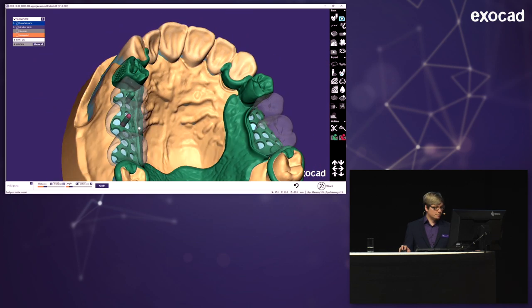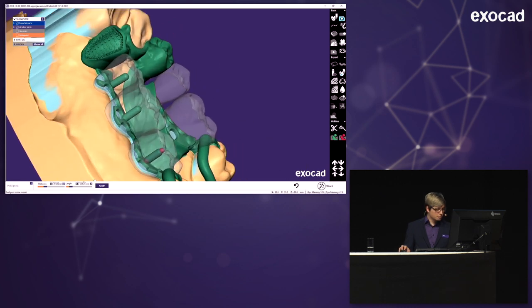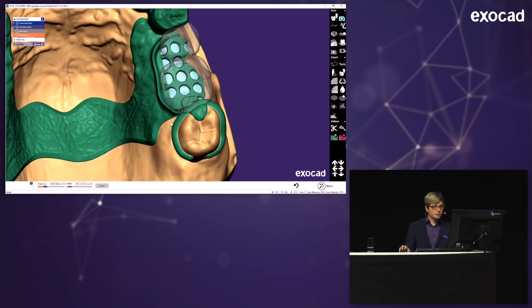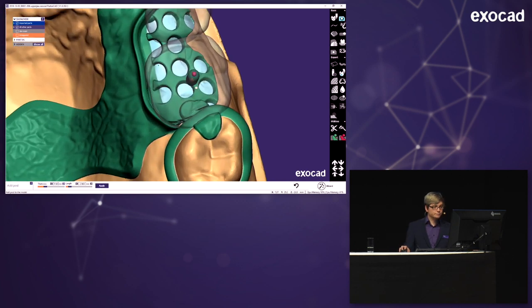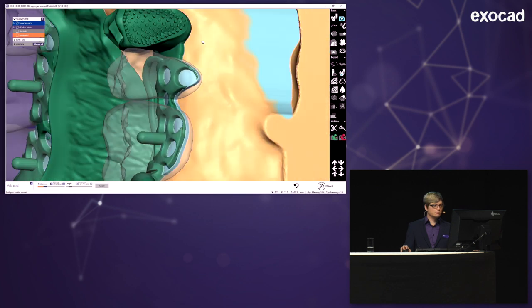And then again, I personally would really like to look at the tooth, and I'm just changing the height a little bit so you don't have this giant post looking out of your acrylic tooth at the end. But you see, it's really fast with that.